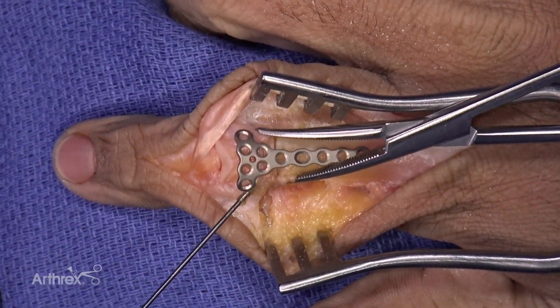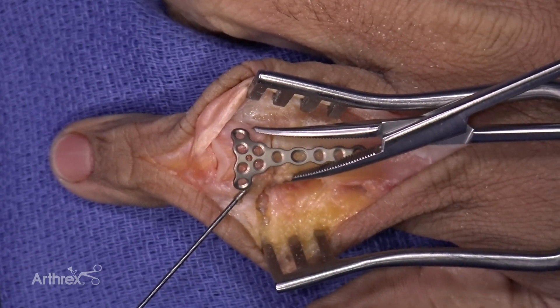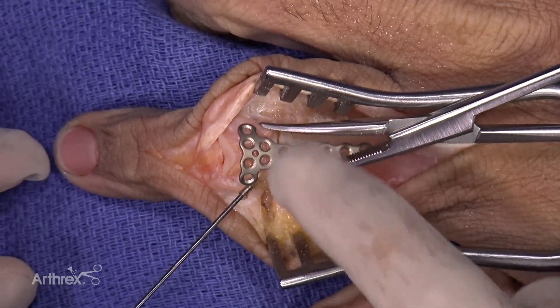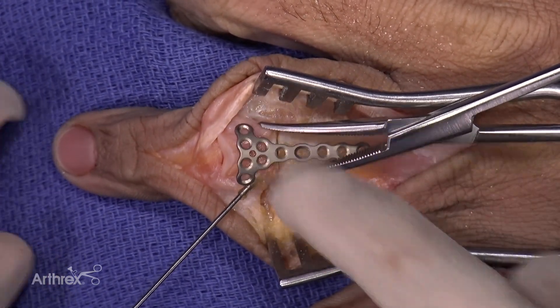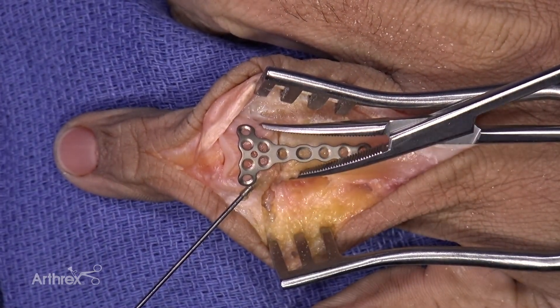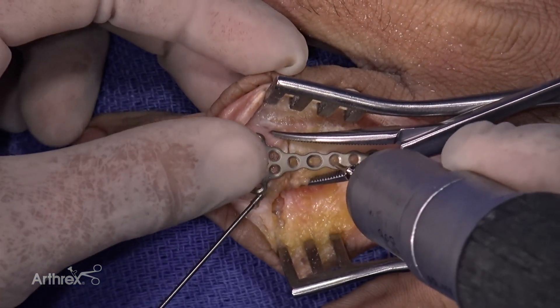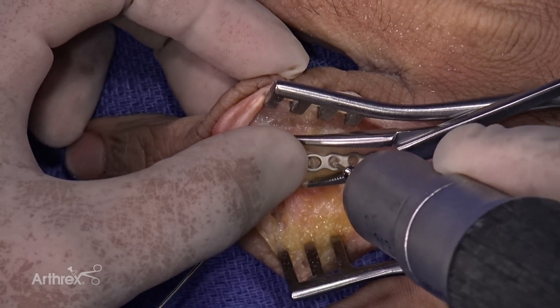Like most of our fractures, we're going to go ahead and place this where we'd like it. You can notice right away, without any contouring, that the triangular plate already fits very nicely onto the distal aspect of the proximal phalanx. I'm going to take this BB tack and hold it provisionally.